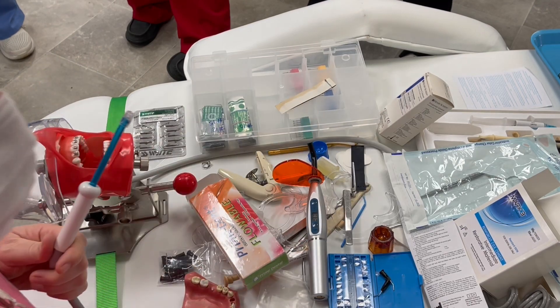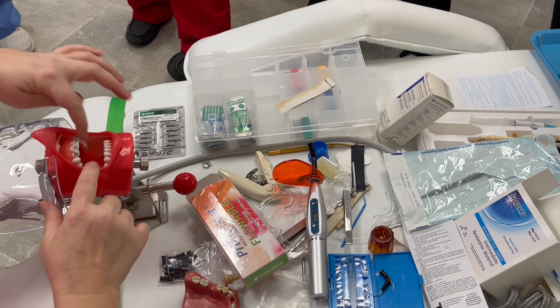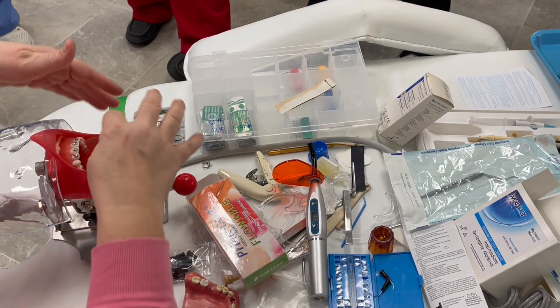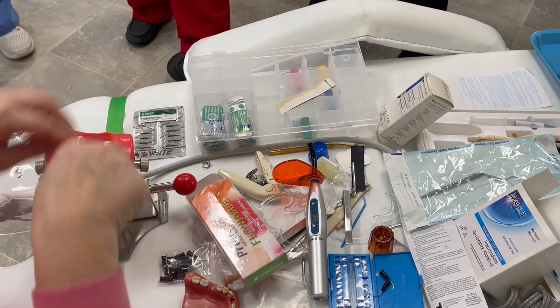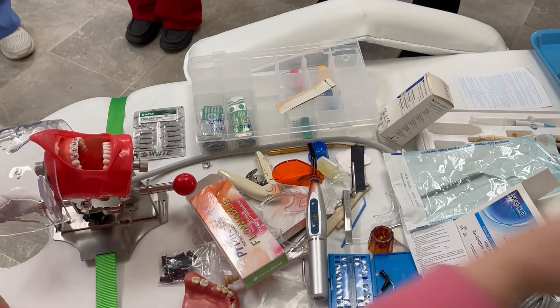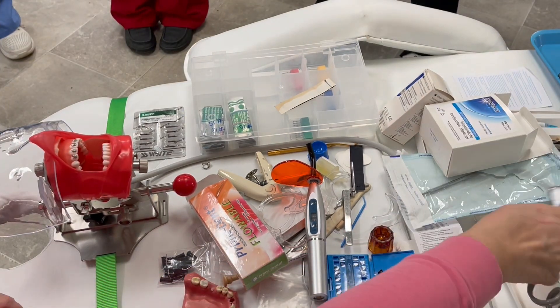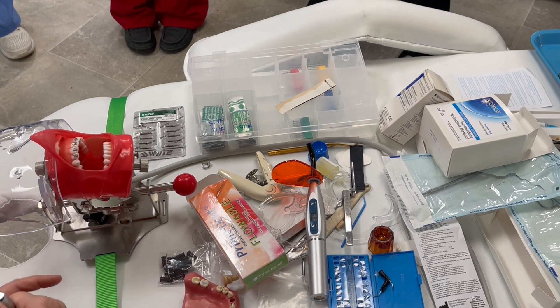So as an assistant, you're constantly looking in the mouth and saying, okay, where do I have saliva? Go behind in that second molar region, the retromolar area, and suction. So we've done our adjustment. The next thing is we've got to take the cotton out. What do I do? Saturate. So we're going to saturate and take it out.